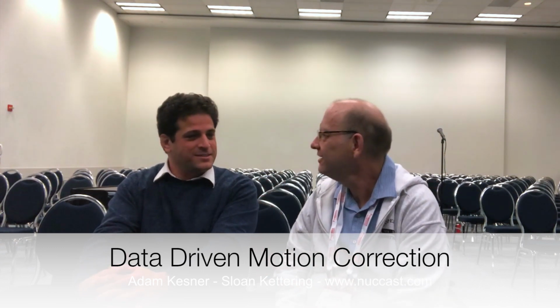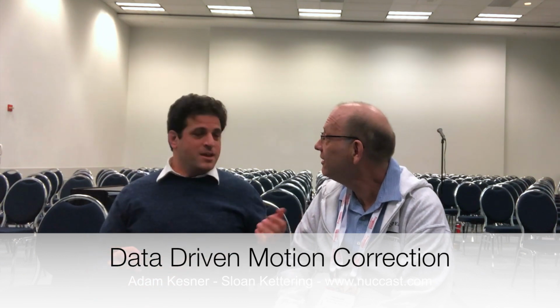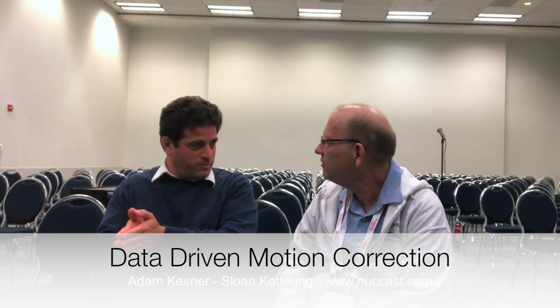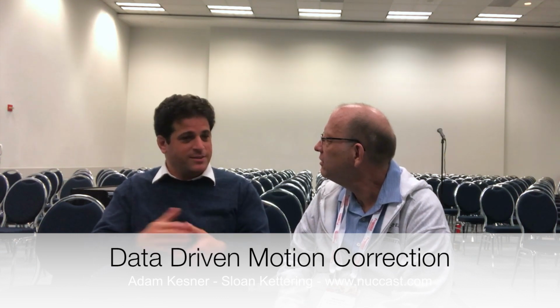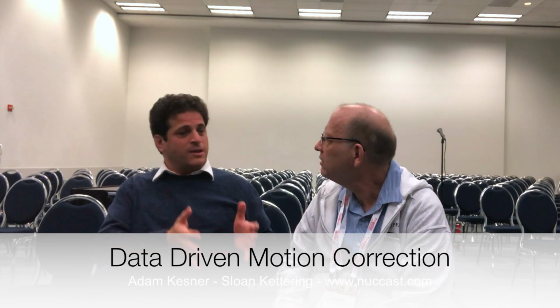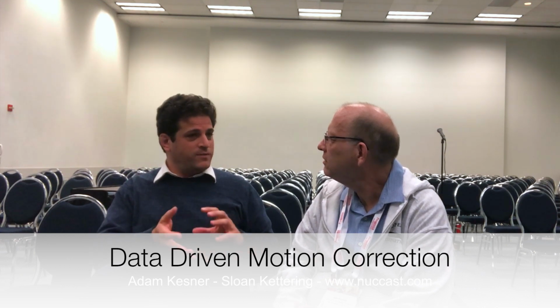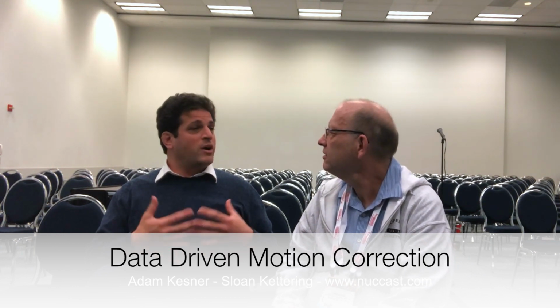So that's another optional way to handle the data. I would say ultimately the way to handle the data depends on what you need to use the data for. But before we get there, this goes back to my interest in data-driven motion correction. If we could take away the efforts associated with acquiring the images, then it changes the equation on cost-benefit because there is virtually no cost to acquiring the images.